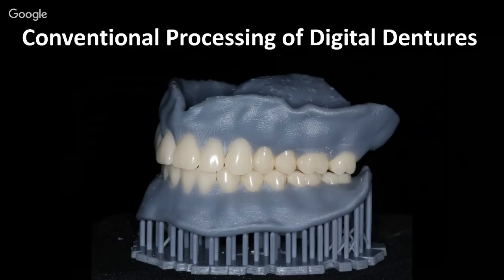So you would do your digital setup. You would plan out your denture bases, do everything we've shown to this point, but you would just print it in this other material. And rather than bonding the teeth in, get a sheet of base plate wax, roll it up, and put just a drop of molten wax in each socket and press that tooth into place. That's just going to hold the tooth into place where it doesn't fall out if you hold the base upside down. So here's this, we'll call this our waxed denture tooth setup, or our wax try-in.